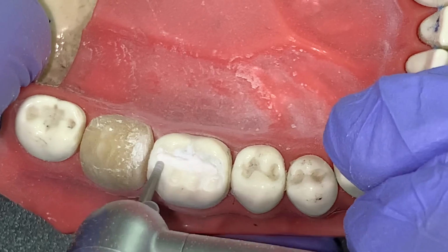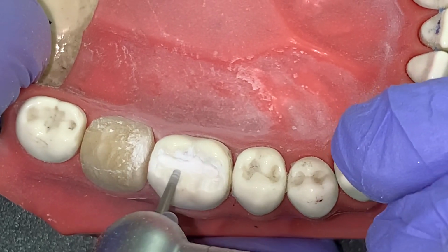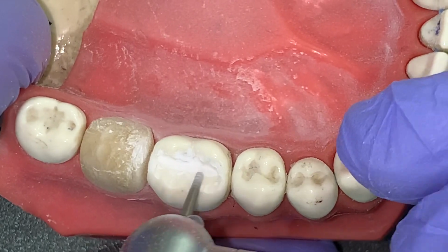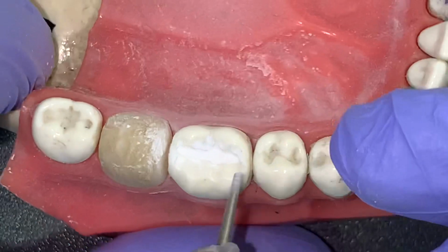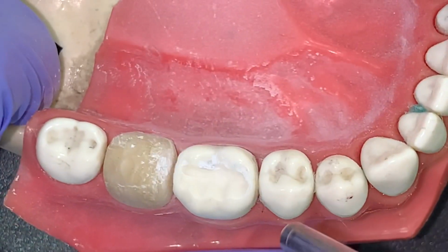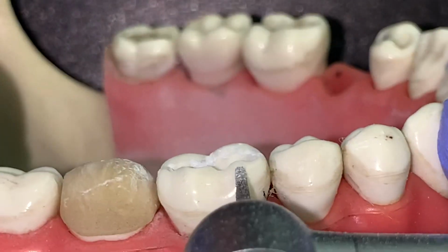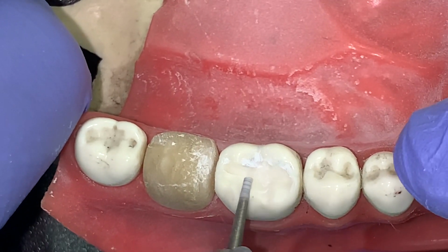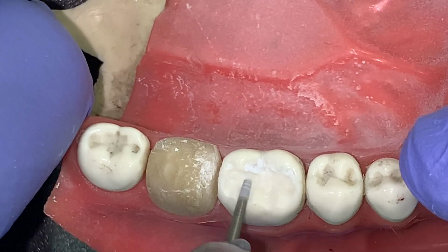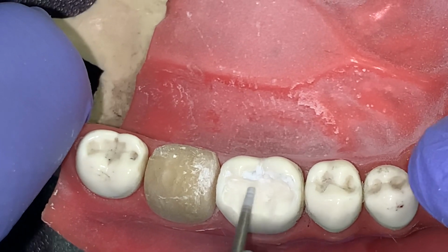So how making a class 1 kind of cavity in the center helps is, your preparation will not be under prepared in the center of the tooth. So your ceramist or your lab technician will be comfortable in placing the restoration in the center or giving some beautiful grooves in your restoration.